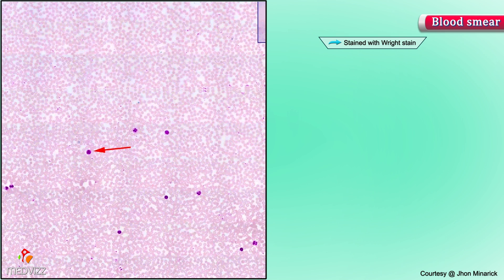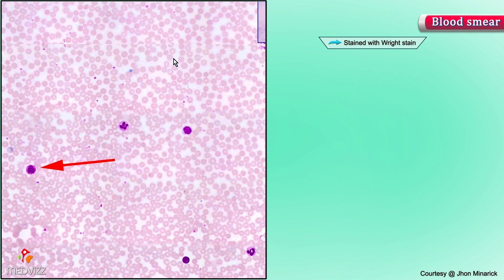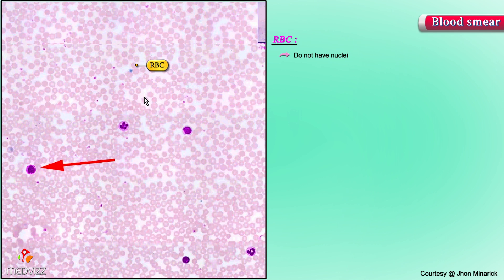There are several different types of cells classically on a blood smear. The overwhelming most common type of cell are the small round red cells with a slightly lighter cytoplasm centrally. They do not have nuclei — these are red blood cells. There are about five million of these per cubic millimeter of your blood.